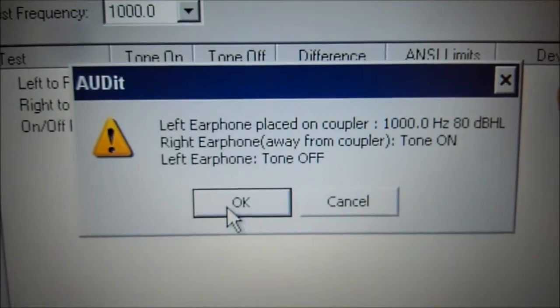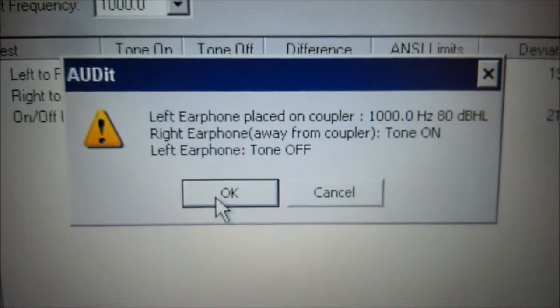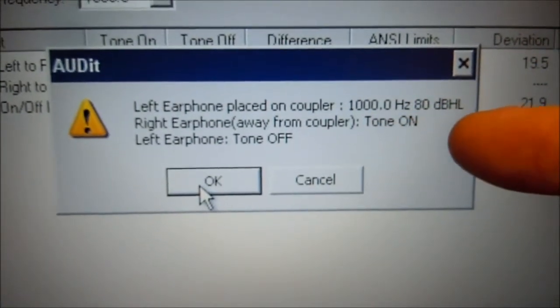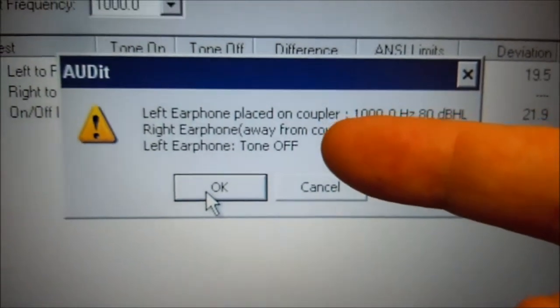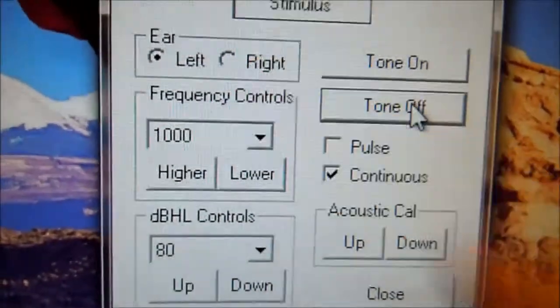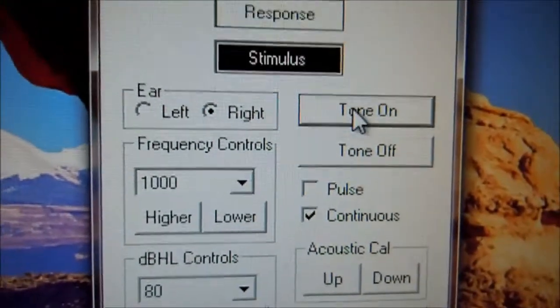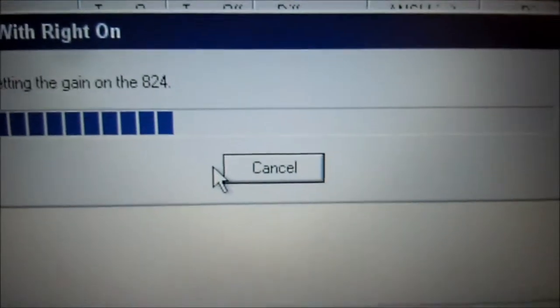Now we're going to make sure the left ear is on the coupler at 1000 Hz, 80 dB. The right ear is away, but this time we're going to turn the right ear tone on and leave the left earphone off. So we're going to select the right ear and turn the tone on — the right ear tone is on. We'll come back over to the audit software and press OK — it's measuring.